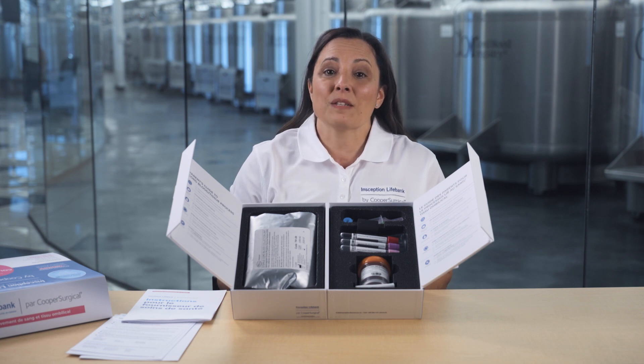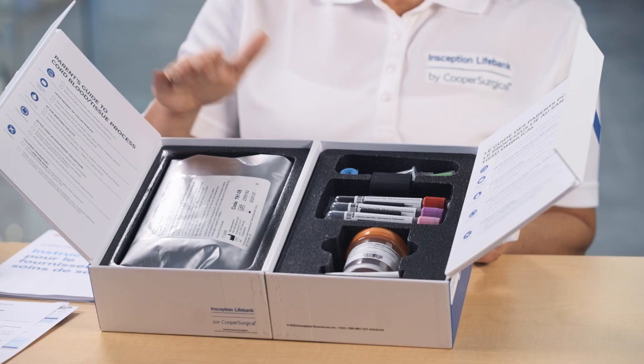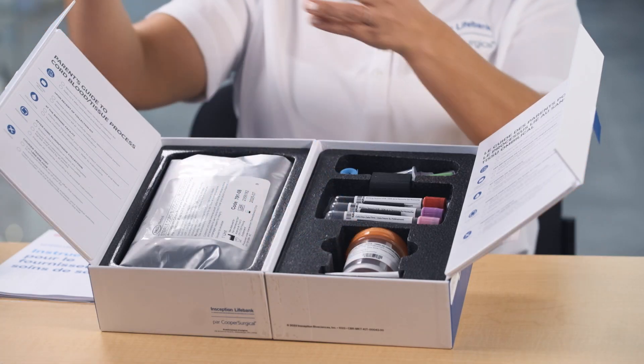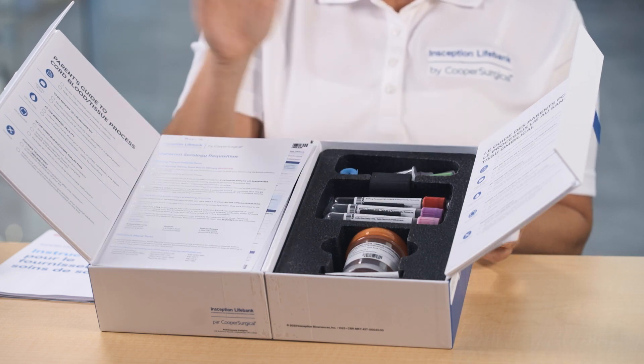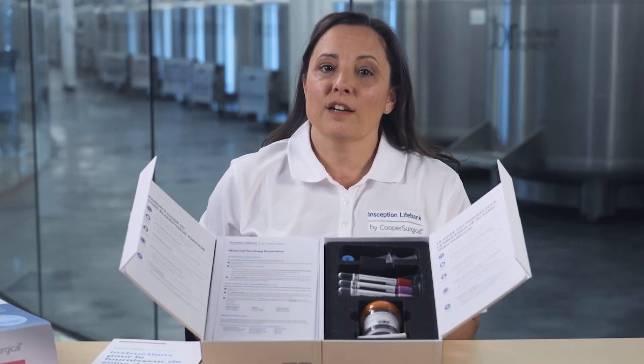Make sure your birthing partner is prepared for this step. Look inside the kit and make sure everything is in there properly — look for the cord blood, the cord tissue if you have collected it, the data collection sheet, the maternal blood tubes and the maternal serology requisition. If everything is there, then the kit can be sealed up for shipping.